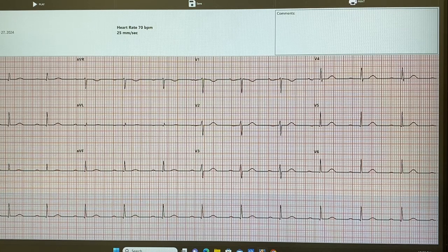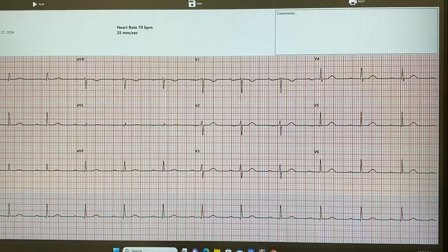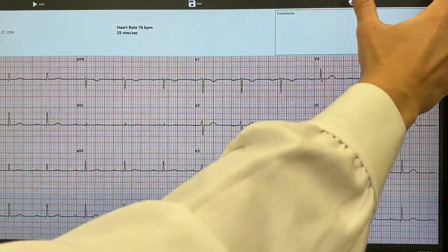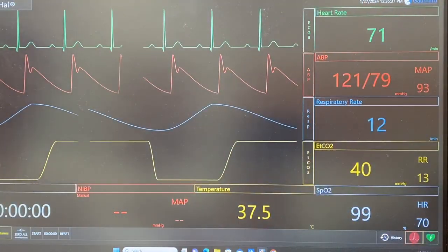Could I bother you to put up a third degree? No, because I will tell you. You will tell me what the rhythm is when it comes. Nice try. Sorry, go ahead and X that out. I got nerdy right now. Okay, all right, back to you, Jessica.